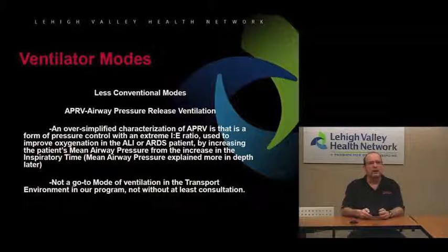And it does this by increasing the patient's mean airway pressure from the increase in the inspiratory time. So I'm going to have some more slides on the mean airway pressure, and I think it'll make more sense. But when we talk about an extreme IE ratio, normally you want your expiratory time to be greater than your inspiratory time, and when it's not, it's said to be an inverse IE ratio, and that's something we normally wouldn't do on our own, at least without consulting with somebody, unless maybe we're picking somebody up from an ICU that's already on an inverse IE ratio.